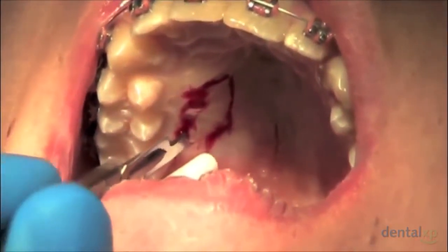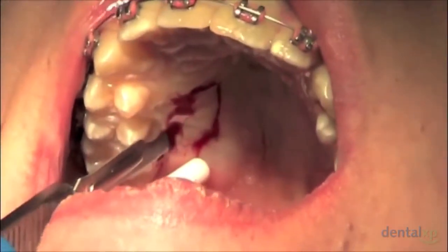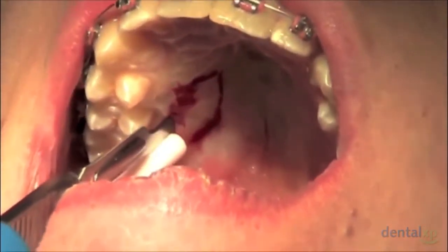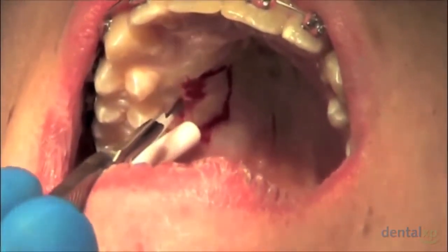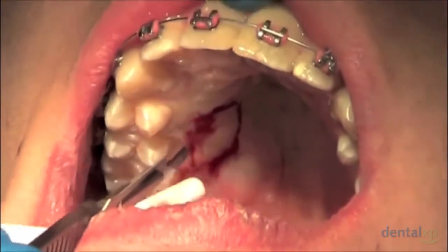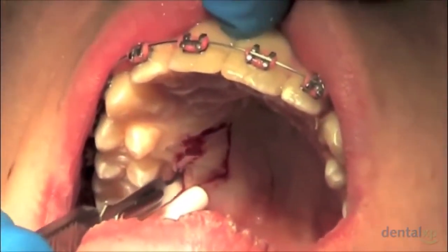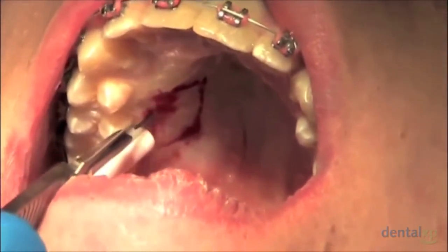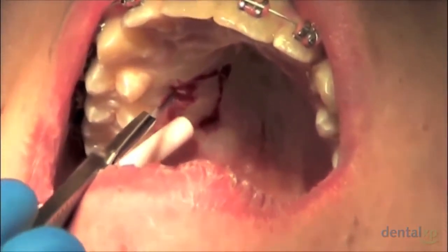Now that the donor site has been roughly outlined, I want to point out that the depth of the incision is roughly about 1.5 millimeters, which equates to about the size of the bevel of a number 15 blade. So what we're doing next is just sharply dissecting out the donor tissue, which once again will include both the epithelium as well as the underlying connective tissue.